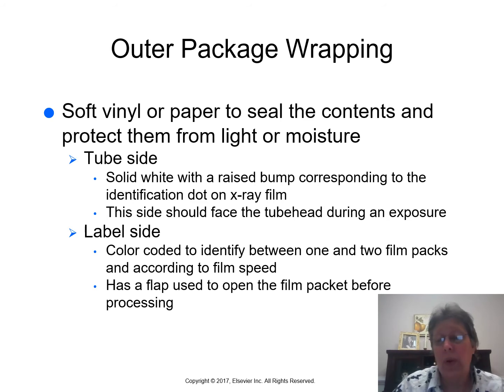The lead foil is disposed of, but it has to be disposed of in a sealed container because since it's lead, it's considered a hazardous waste. The black paper can go directly in the trash. When we're done with the outer vinyl wrapping, it can go in the trash. And of course, we'll process the film and keep that for our x-ray.